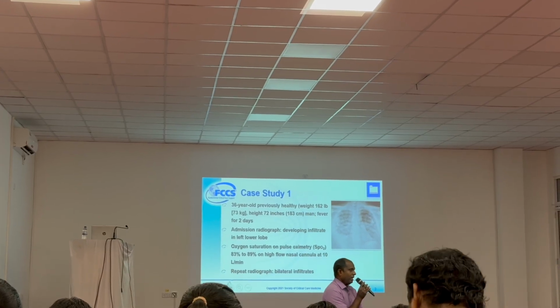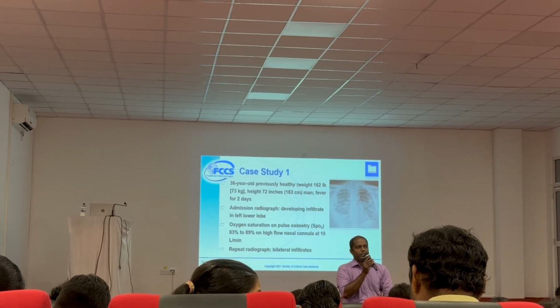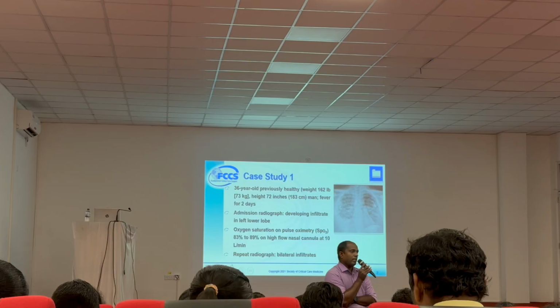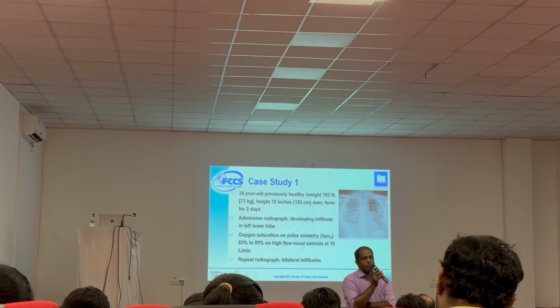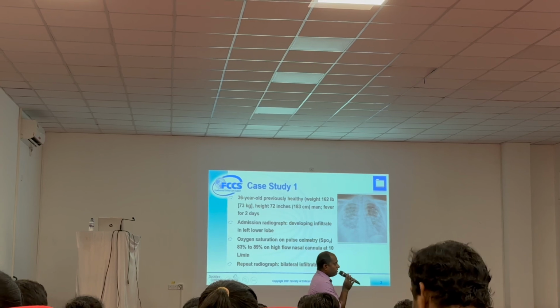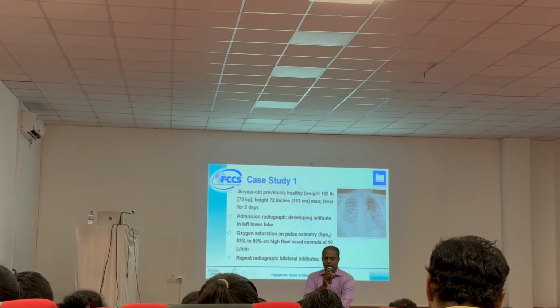If that's not happening, the air is stuck there, then that means it keeps the alveoli a little bit more open and creates more pressure. That is auto PEEP. So each and every time the air gets stuck there, it will generate more auto PEEP. These are concepts we will discuss later. I will go through the slide later, but we need to get some idea about what we are doing. Now, come to the case.